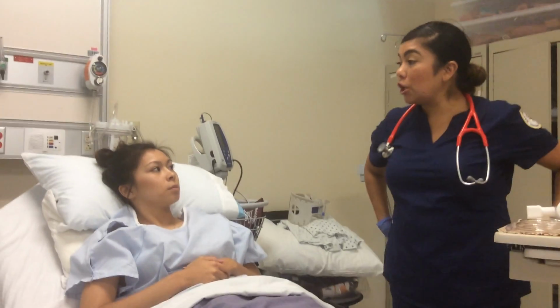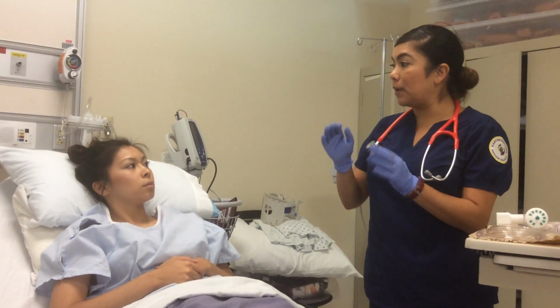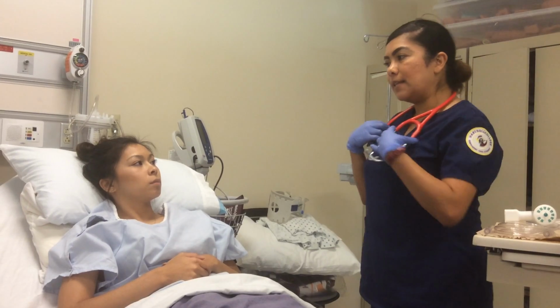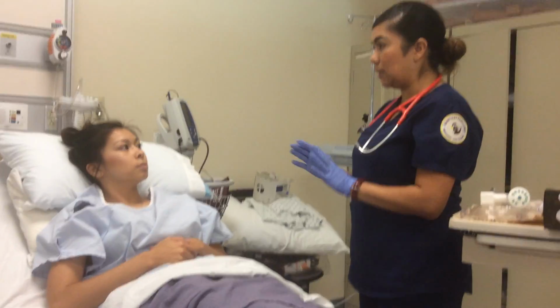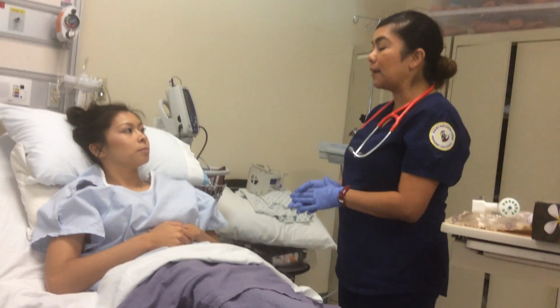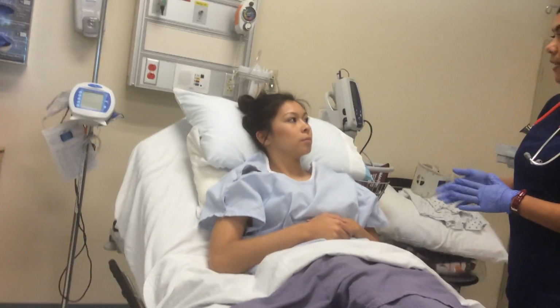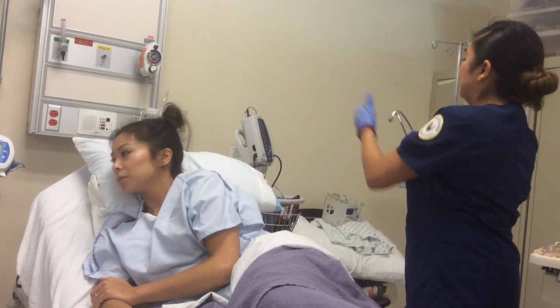And I'm going to start off on both ends. I'm going to start off on the bottom and work my way up. Okay? And if at any time you feel dizzy or lightheaded, please just let me know. We could go ahead and take a little break. Okay? I am going to ask if you could just turn slightly to your side. Okay? Is that okay? Okay.